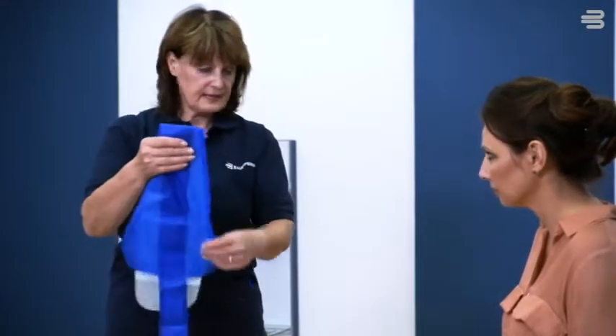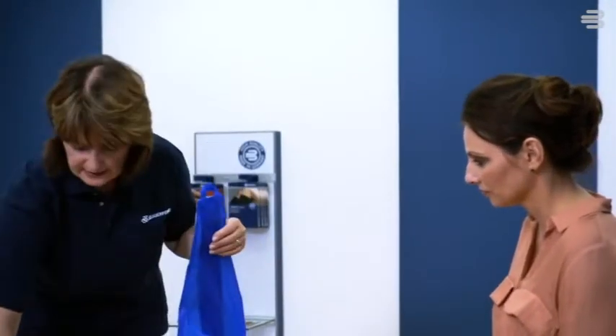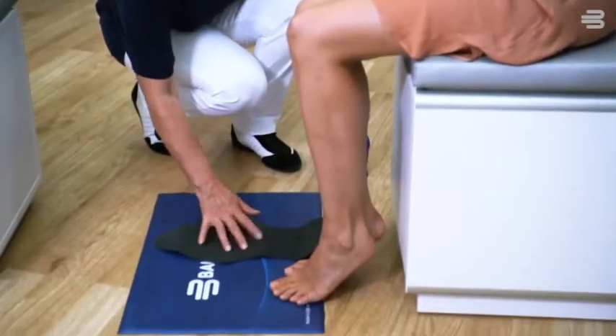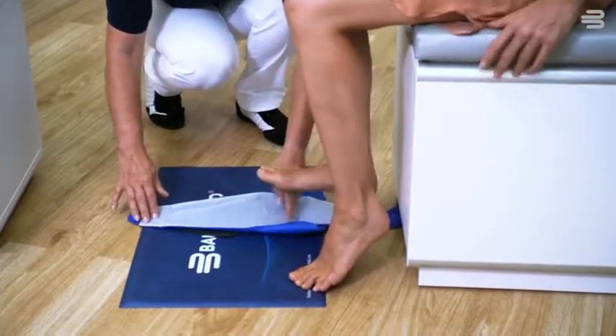Crumple the new glider before using it for the first time. Place the non-slip mat in front of your feet. Position the glider on the mat with the white side facing upward. Place your toes on the perforated line and swing the foot forward into the material.